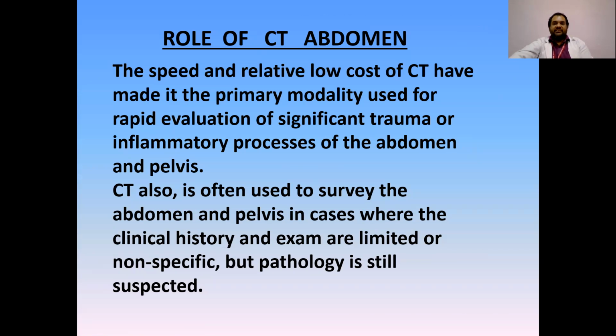The speed and relative low cost of the CT have made it the primary modality used for the rapid evaluation of significant trauma or inflammatory process of the abdomen and pelvis. CT also is often used to survey the abdomen and pelvis in cases where the clinical history and exam are limited or non-specific, but pathology is suspected.